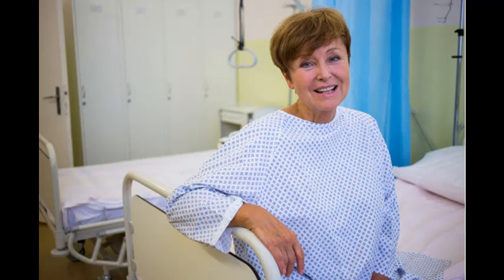And you think about it, as a facility you can help way more people if you are able to deliver a relatively equivalent dose of therapy compared to standard fractionation, give the same benefit, but do it in a faster, more condensed way. Essentially, they're done with their treatment in a week. That enables the next person to enter their spot and be completed in a week.